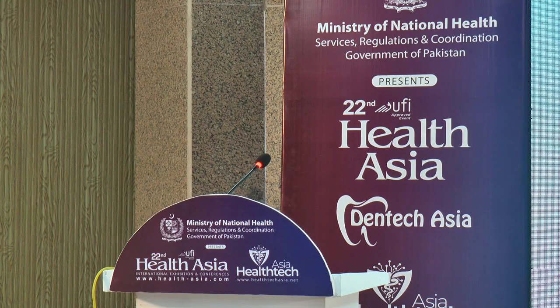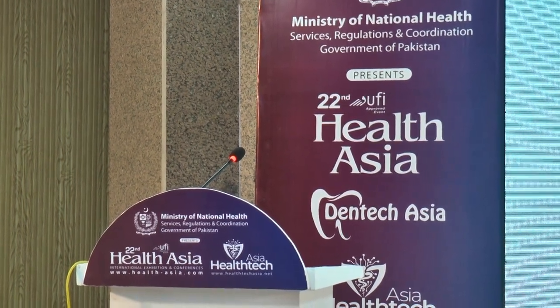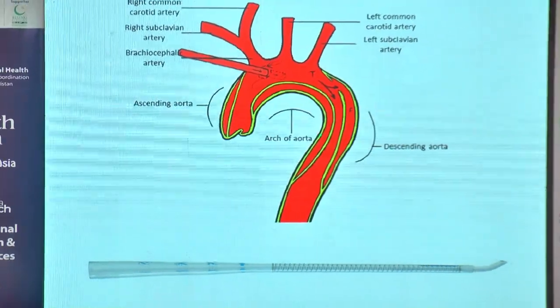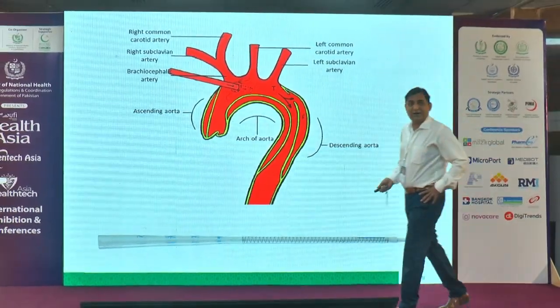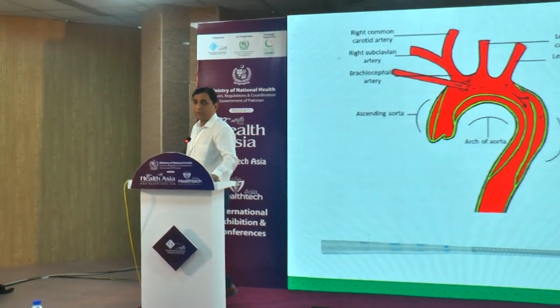and we snug these two arteries, the left subclavian and left common carotid arteries. Why do we clamp these two arteries? To avoid embolism to the brain. Then we start the selective antegrade cerebral perfusion. Usually we use this aortic cannula. You can see the tip. This tip should be turned from descending to ascending when we start selective antegrade cerebral perfusion. Hope you guys understand.